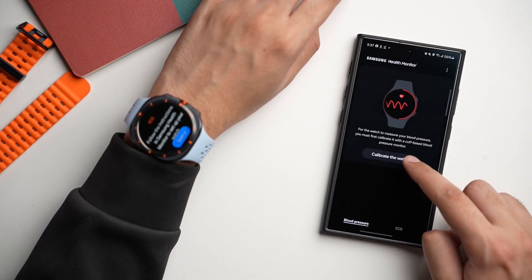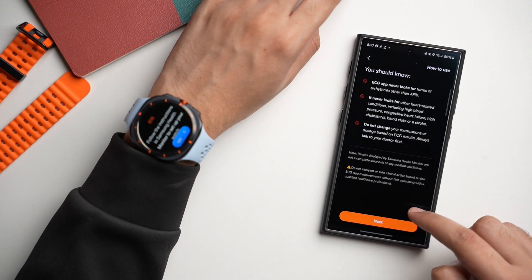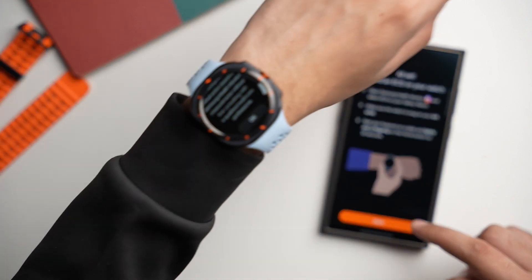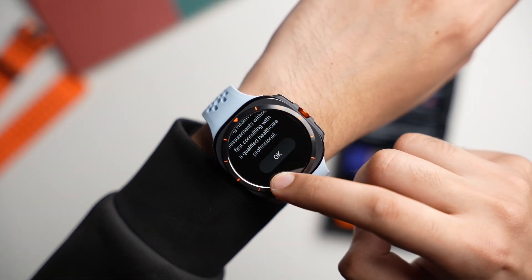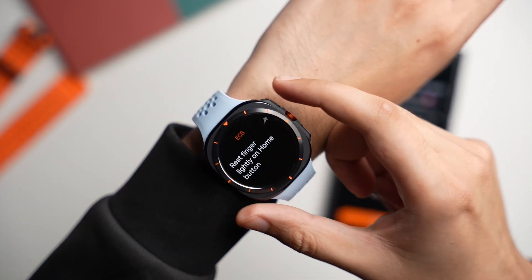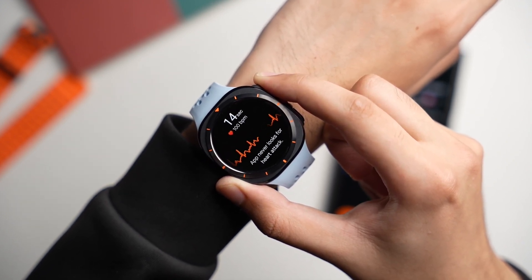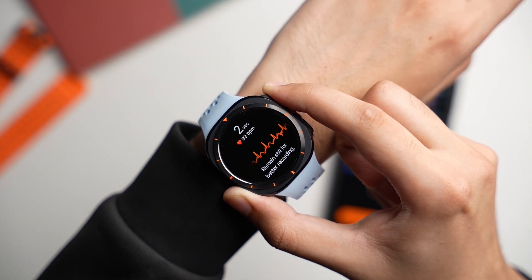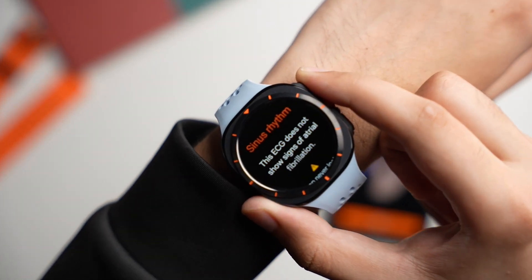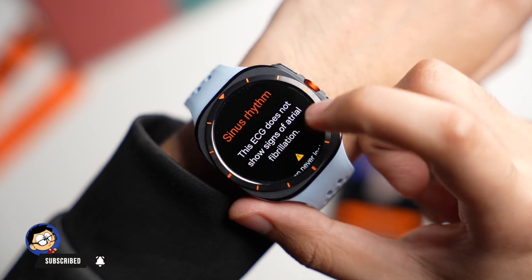First I'll be doing an ECG on my Galaxy Watch, so tapping on ECG. It shows some instructions — make sure your watch is snug fit, meaning not too tight and not too loose. Sit back, relax, and let your Galaxy Watch take the reading for 30 seconds. By the way, this app will also turn on irregular heart rhythm notifications on your Galaxy Watch, so you don't have to turn them on using another app. This reading shows that I have a sinus rhythm, which means it's okay.